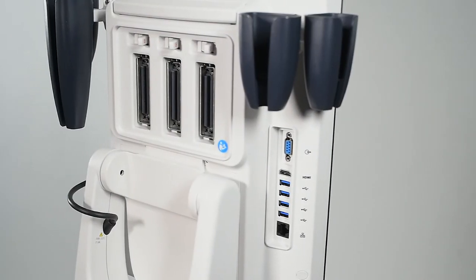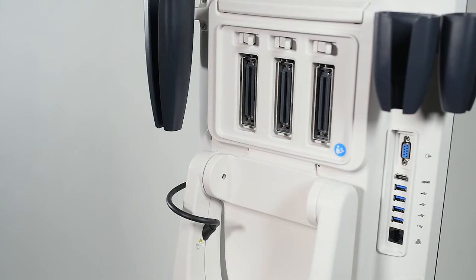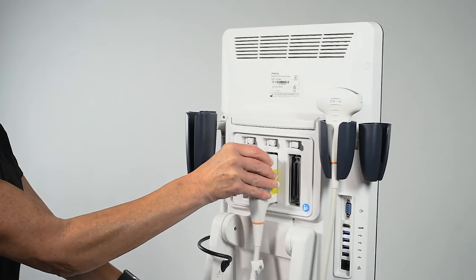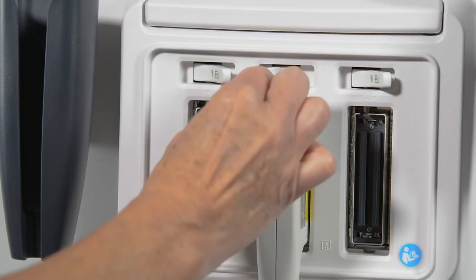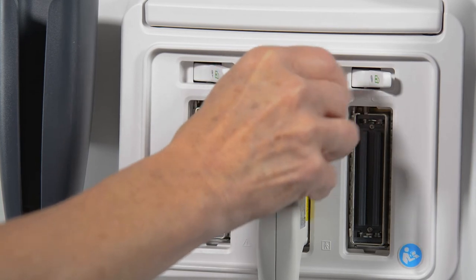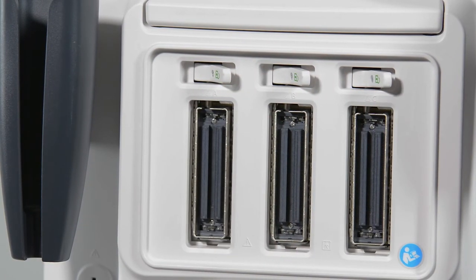There are three active transducer ports on the rear of the TE7 monitor. To connect a transducer, flip the tab to the right to unlock. Secure the transducer and push the lever to the left to lock into place. It is recommended that the system be frozen or powered down to connect and disconnect transducers.